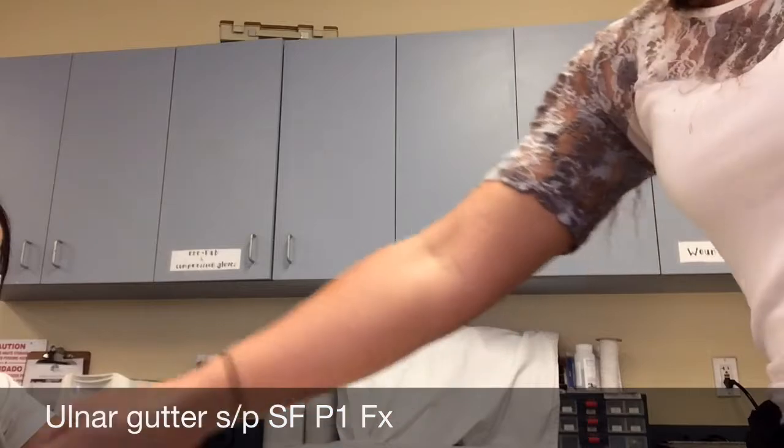Some of the materials that you will need: thermoplastic, paper towel, a pencil, Velcro, and scissors.